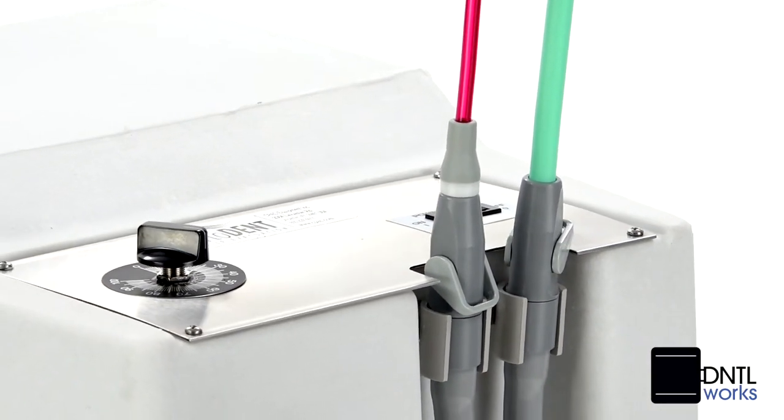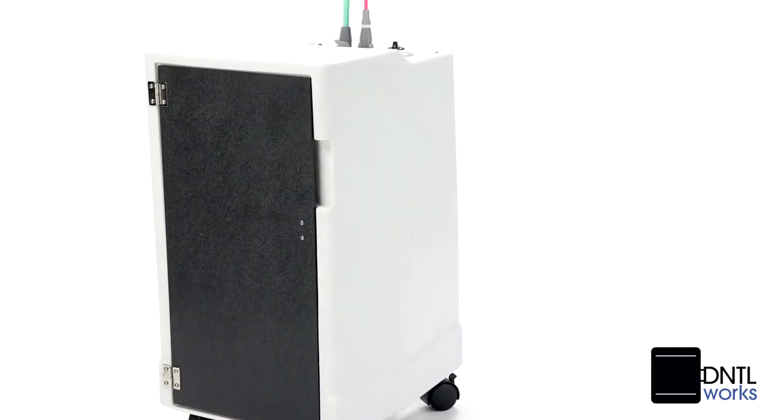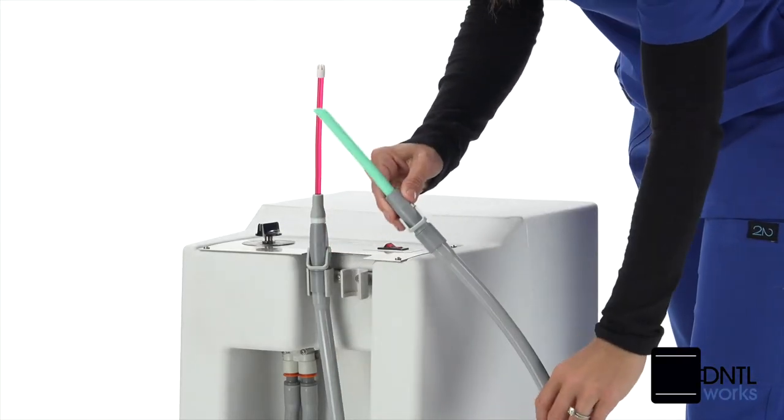The speed of the 7/8 horsepower motor can easily be adjusted to meet your needs. The vacuum's cabinet is made of beautiful white granite impact-resistant polyethylene, with valves on each of the two hoses providing high-volume suction.